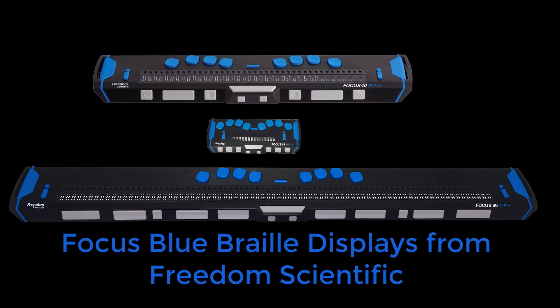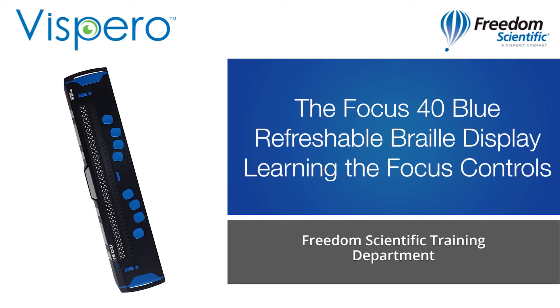Focus Blue Refreshable Braille Displays from Freedom Scientific. The Focus 40 Blue Refreshable Braille Display. Learning the Focus controls.